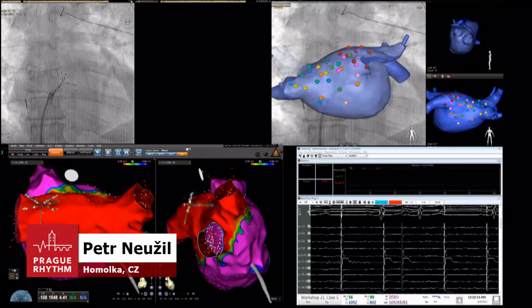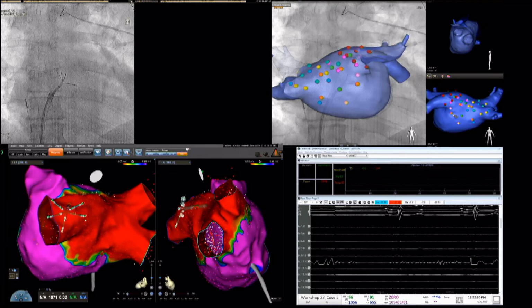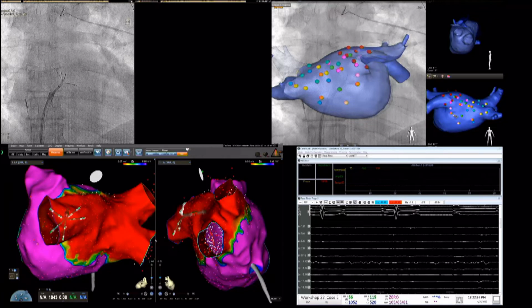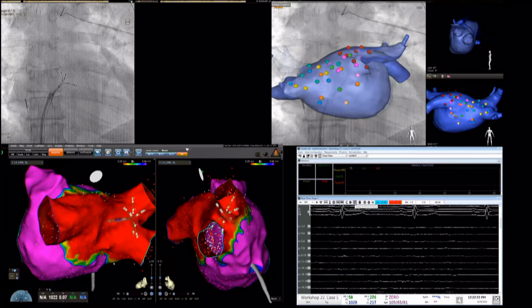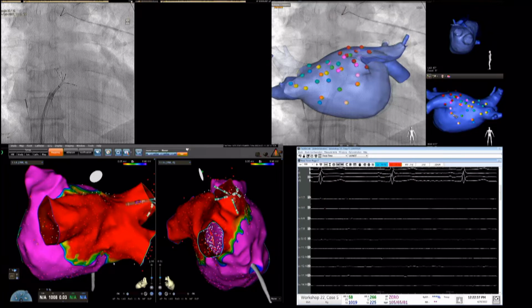So now I'm stopping pacing. So this is the left common. There are some dissociated signals sometimes if I do some maneuvers there. So maybe you can see. And actually, we converted the patient to sinus. Actually, he several times went to atrial fibrillation again. So after this, he's really stable in sinus rhythm right now. Okay, so it's a very important mark.